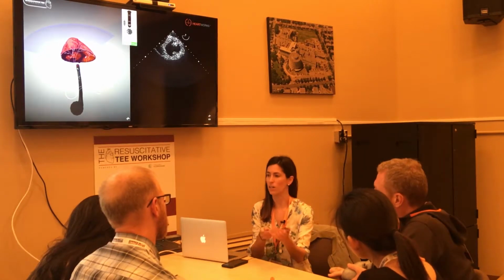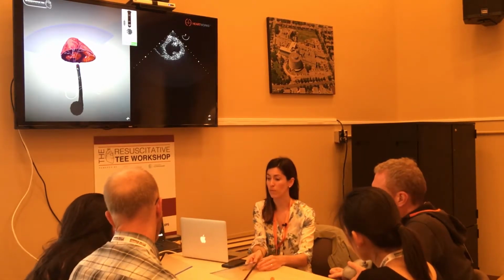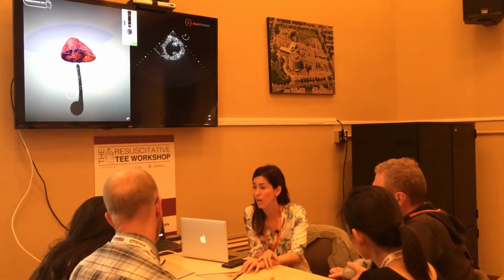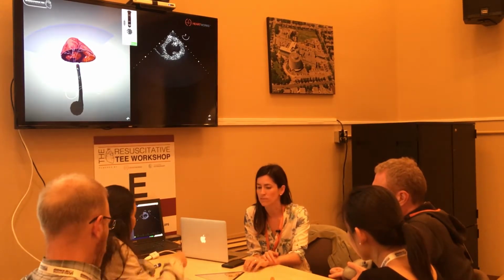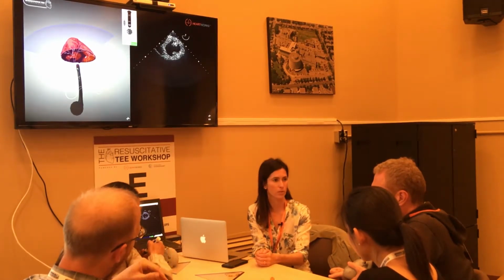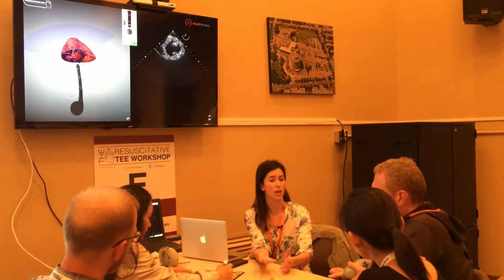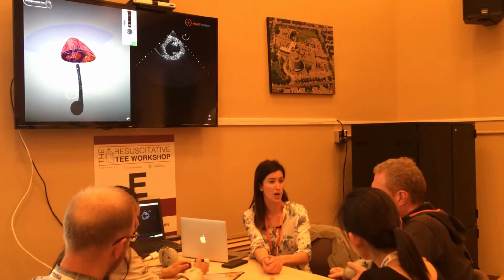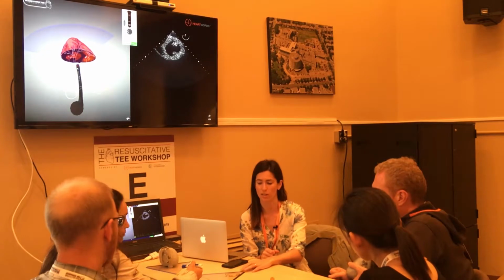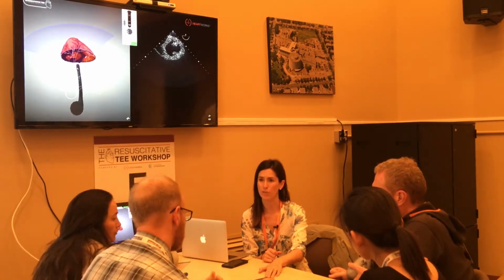Okay, all right. Are you able to label for me with an A where the anterior wall is? So put a little A near the anterior wall of this particular view, right? My patient has come in a cardiac arrest and I'm concerned about a massive heart attack. So I want to know what my different walls are of the left ventricle. Excellent. Inferior wall.